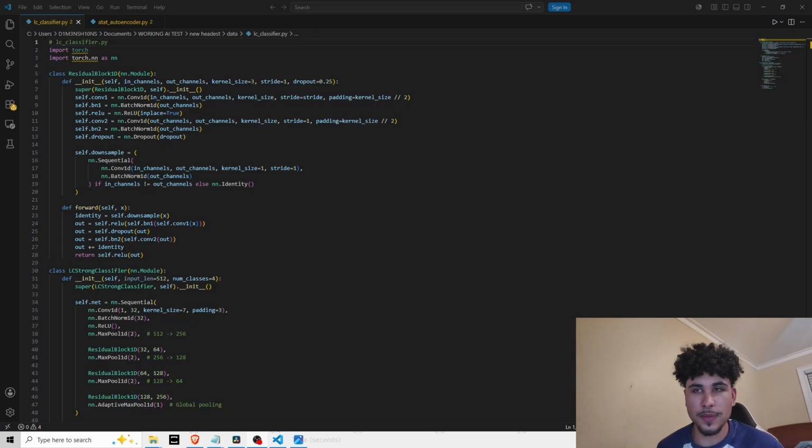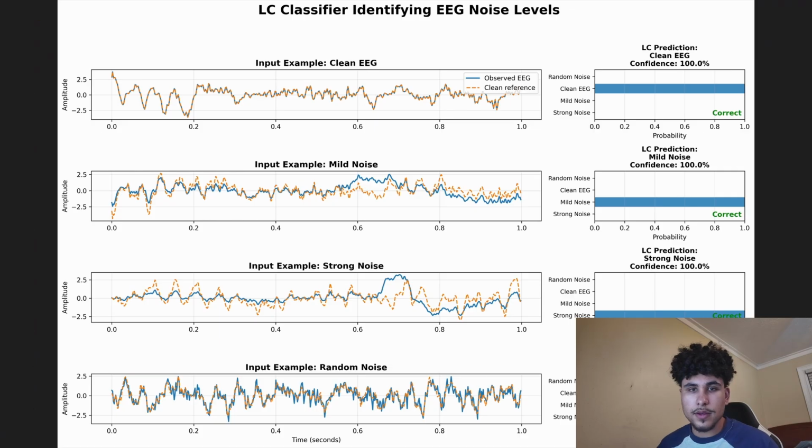So what I have pulled up is the architecture of the LC classifier I coded. An LC is a hybrid combination of an LSTM and CNN machine learning model. Let's take a quick look at a graphic to explain more about what it does. So this is a simple graphic to explain what the LC does. An LC works by identifying shapes and patterns within an EEG dataset to identify levels of noise.